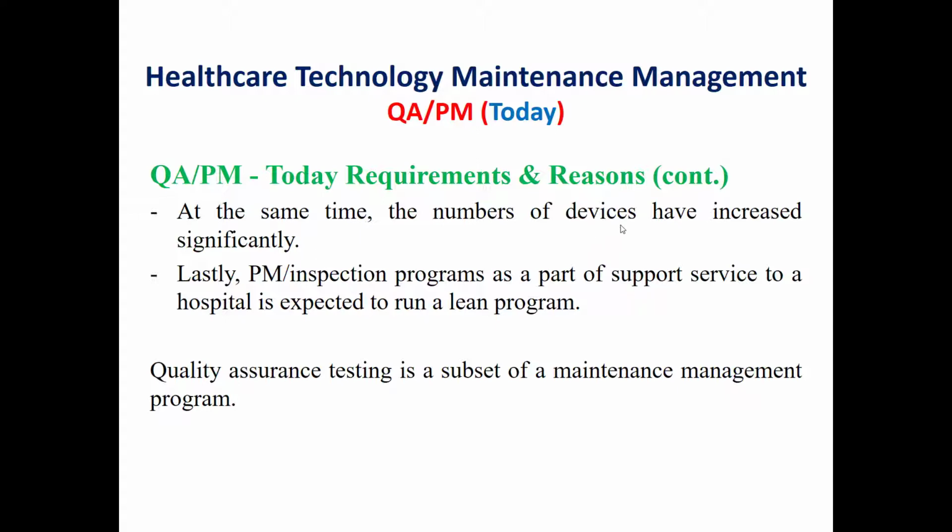At the same time, the number of devices has increased significantly, which means if we want to perform the preventive maintenance and the performance and safety inspection, this needs a large number of staff or biomedical technicians and clinical engineers, which will be a little bit expensive. Finally, PM inspection programs as a part of supportive service to a hospital are expected to run a lean program.